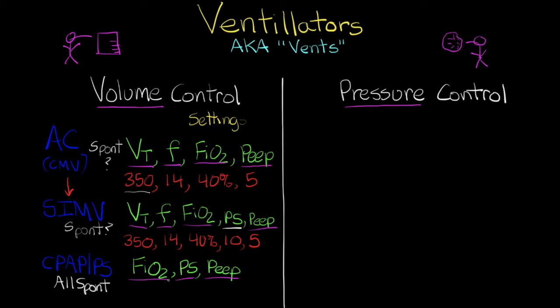Now, it is important to know that sometimes we're just beginning to wake some of these patients up from their sedation, and we're beginning to try to work towards extubating them, and so we will switch them to CPAP and see how they do with their spontaneous breathing.